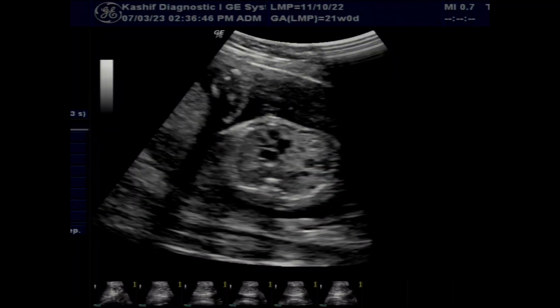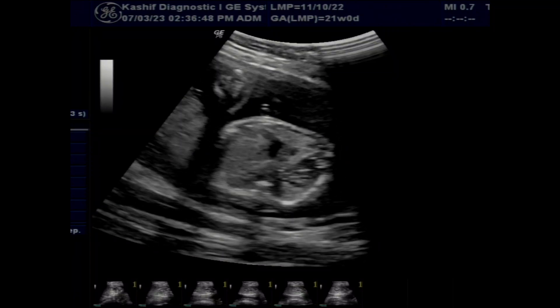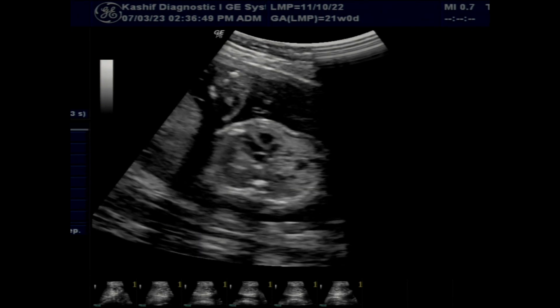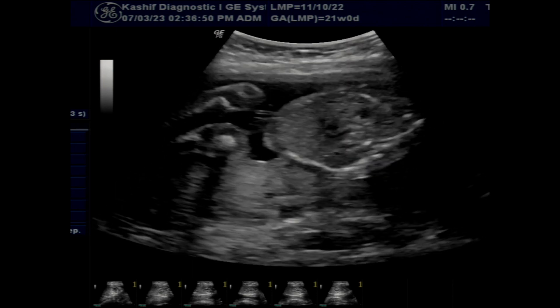This is an obstetrical scan at 21 weeks gestational age. At the start of the scan, we see unilateral cystic areas in the fetal lung.